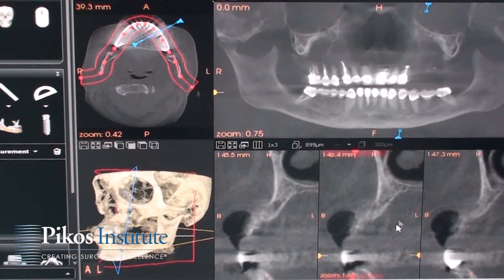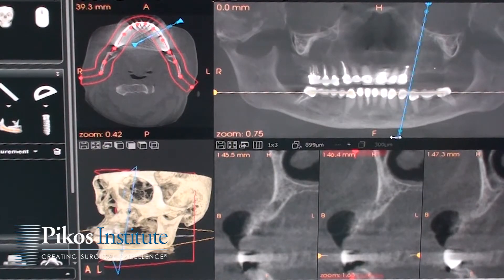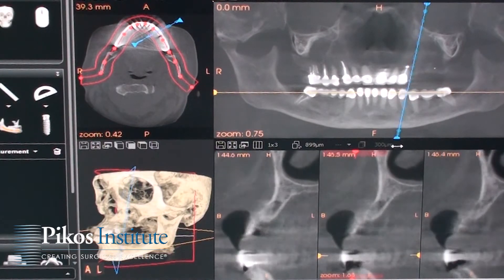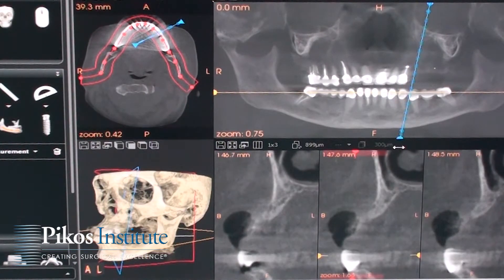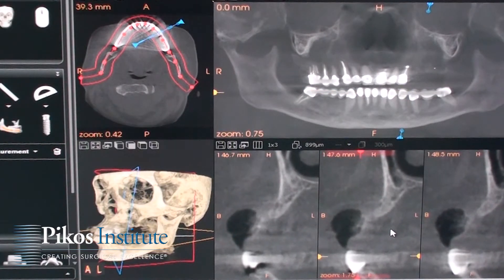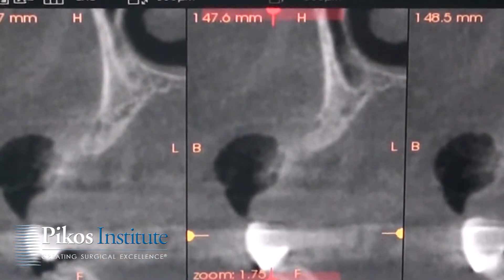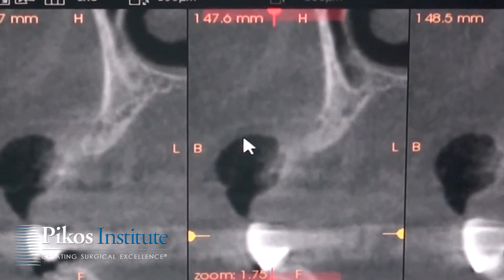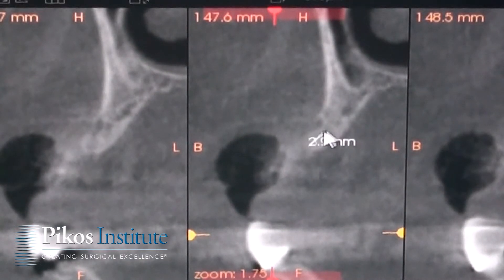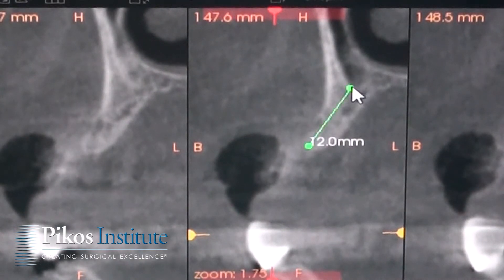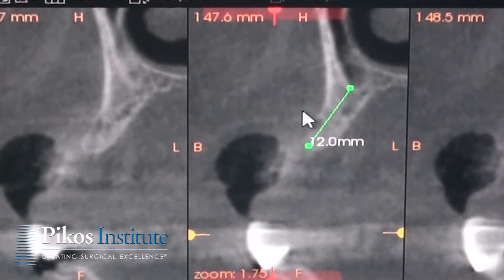As you're going to see, the ridge is definitely on the narrow side, more of a Division B ridge, almost a C-W. We can get a better idea of the existing ridge right here. Using our measuring device, we'll take a look at height. Height is not going to be an issue in the number 12 site — we're approximately 12 millimeters in height.